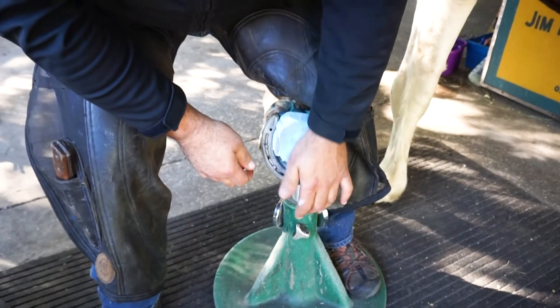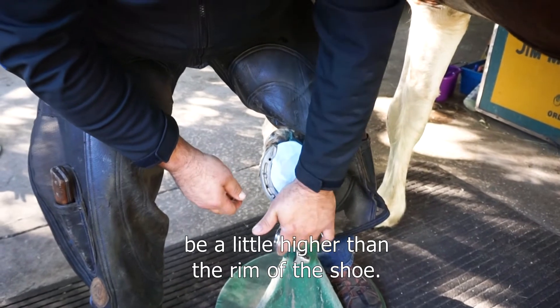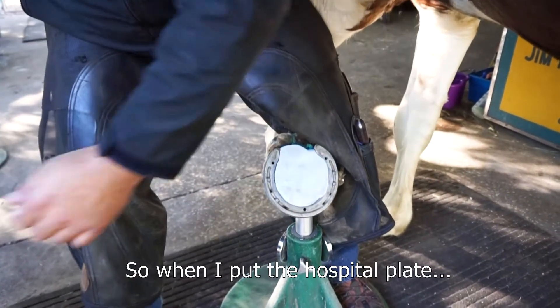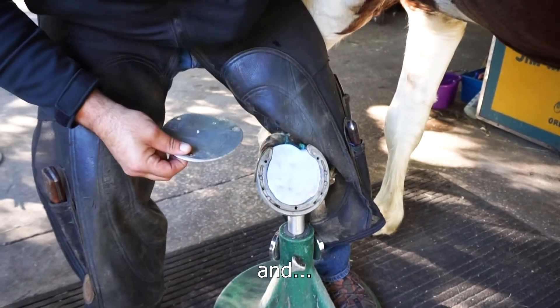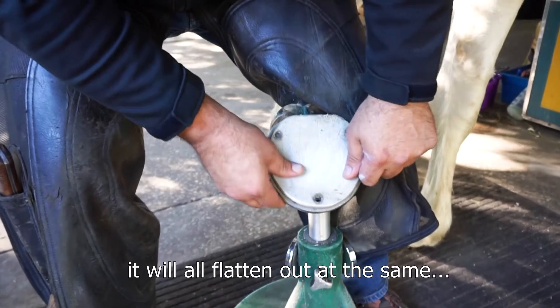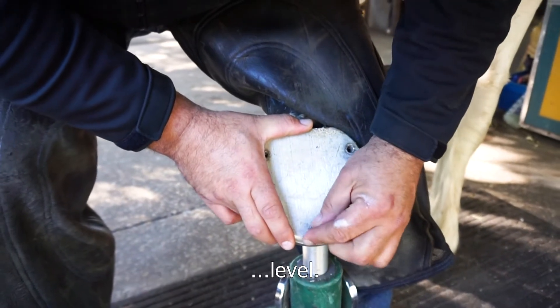We're going to pack it and I'm going to let it be a little higher than the rim of the shoe, so when I put the hospital plate on and the horse applies pressure, it'll all flatten out at the same level.